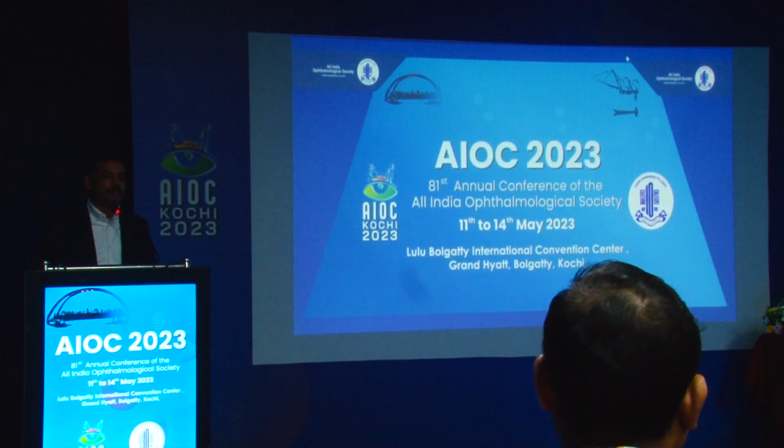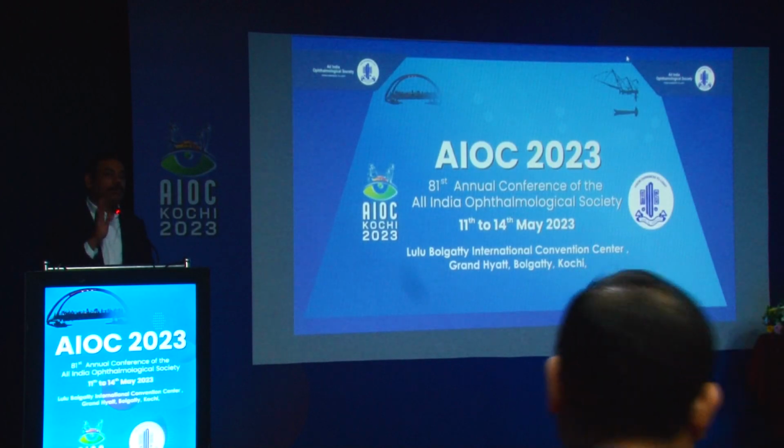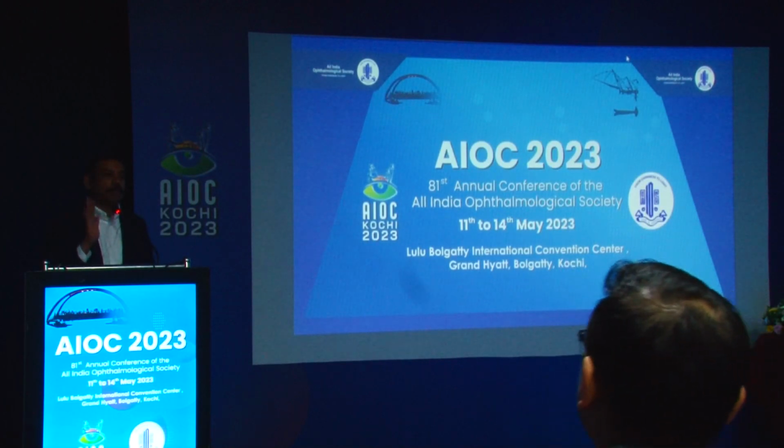In a few of my patients, I am following up for the last 4 years, and their pressures are not going above 12 millimeter of mercury. So it sometimes works very well. The other trick I can give you is don't do it in those who are having less than 22. Okay, sir.